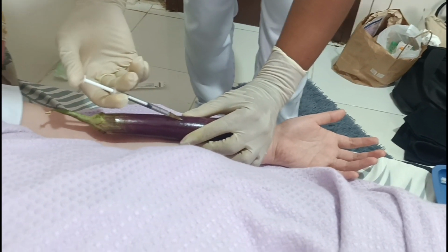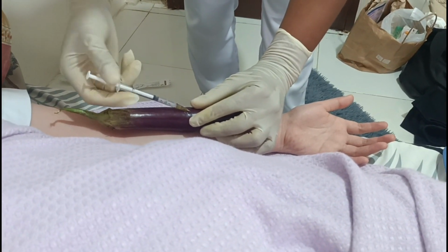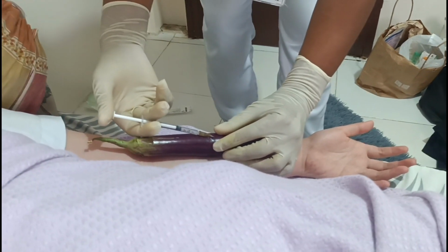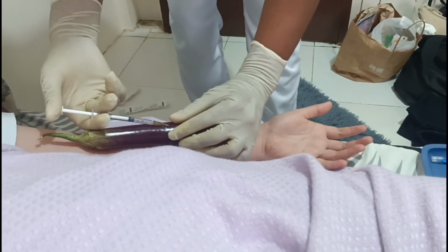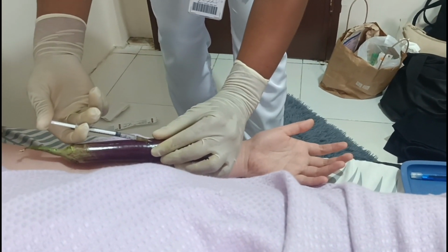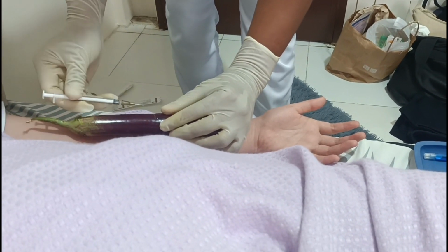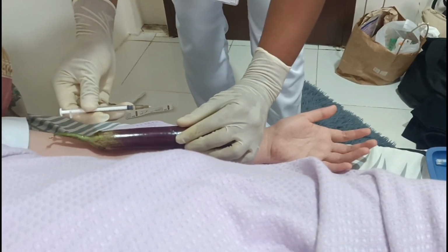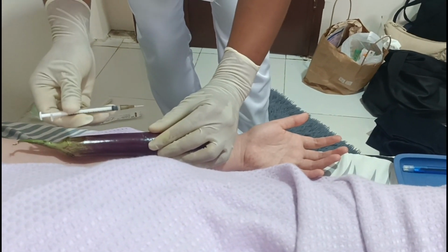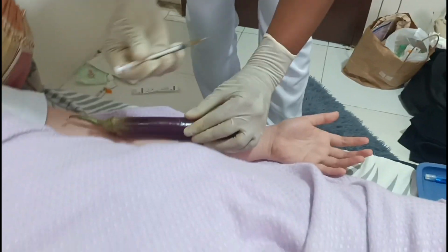And slowly inject the medication and feel the resistance until you see a bleb that resembles a mosquito bite appear on the patient's skin. If it appears, this means that all the solution is in the intradermal tissue. Now withdraw the needle at the same angle that it was inserted to minimize tissue damage and discomfort for the patient. And pat with a dry cotton ball and do not massage the area.